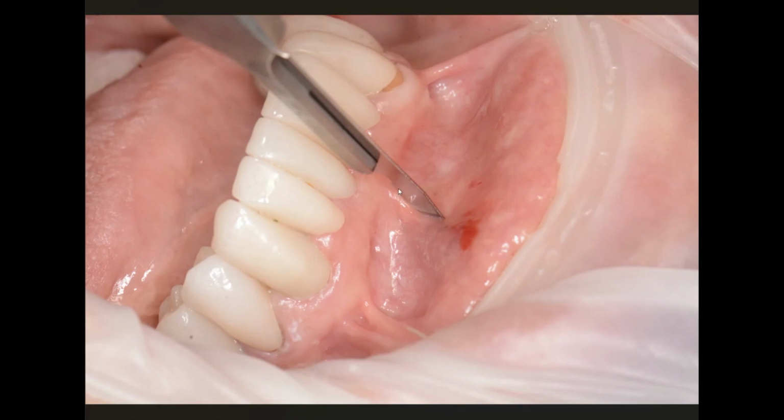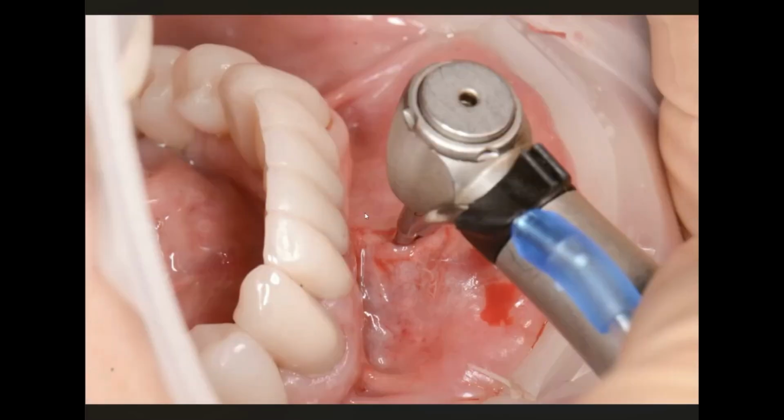So this is where I start with my technique, this number 15 blade. I'm going to make an incision right in the central labial frenum down to the bone. I'm not going to carry this all the way up. I'm not going to disturb the mucogingival junction around the teeth.